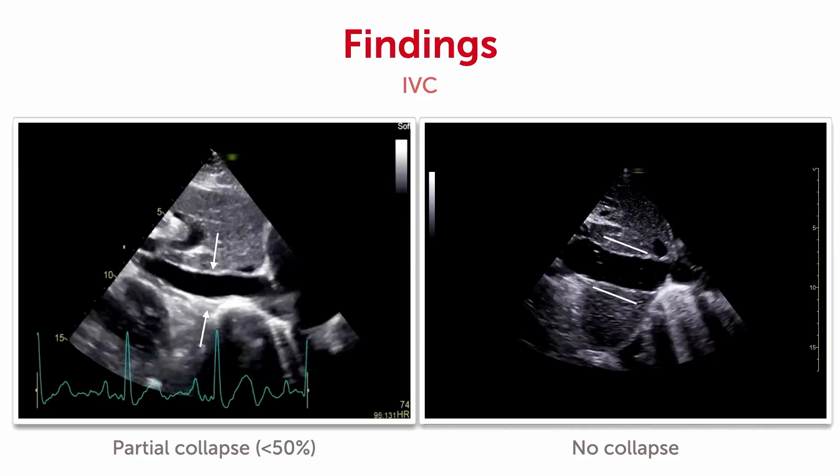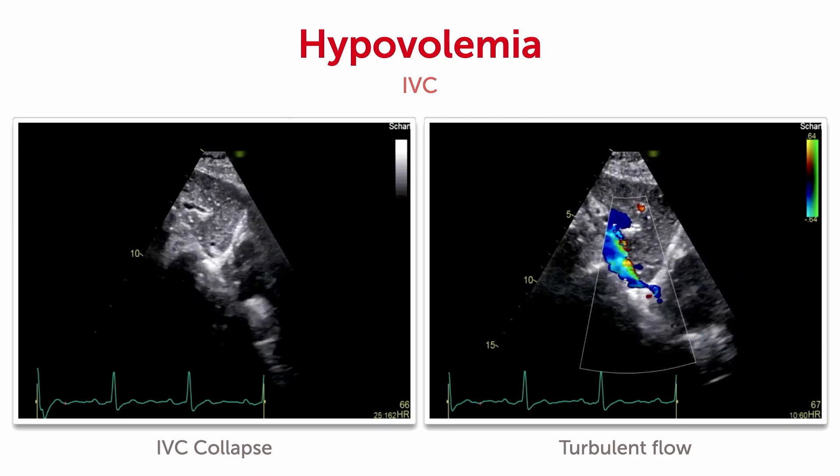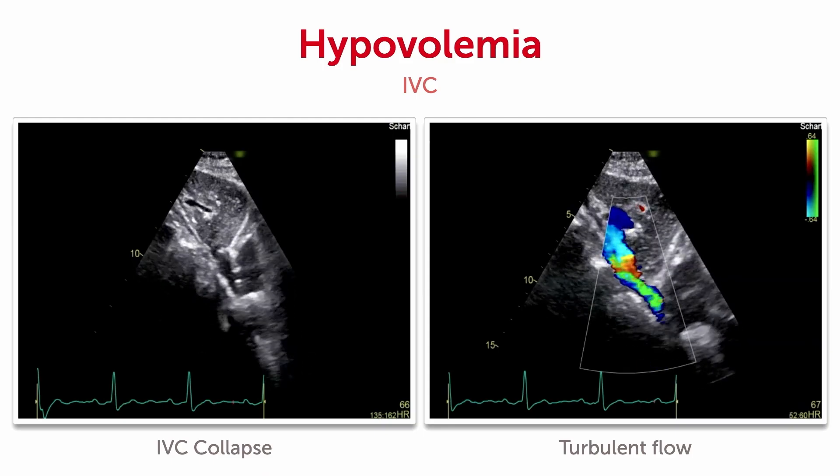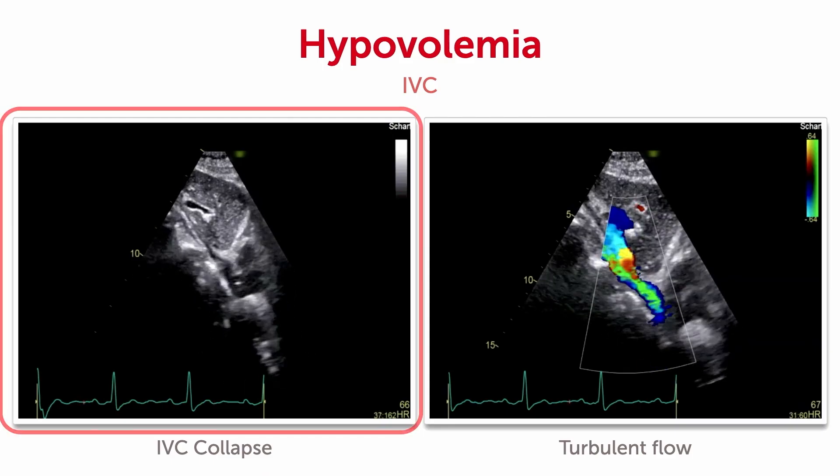In which situations in shock would you expect a very narrow IVC? If patients are hypovolemic — for example if they're bleeding, or if they have too many diuretics on board — in this situation you will have a complete collapse of the IVC, as you can nicely see on this example on the left.